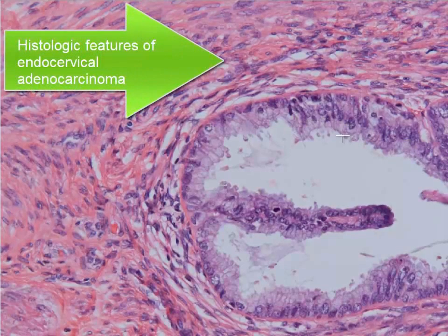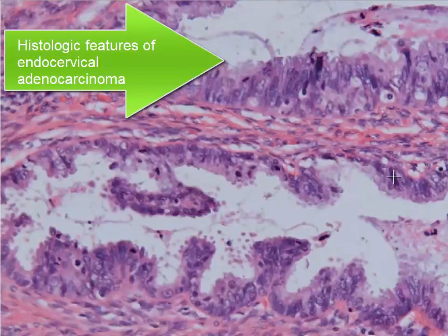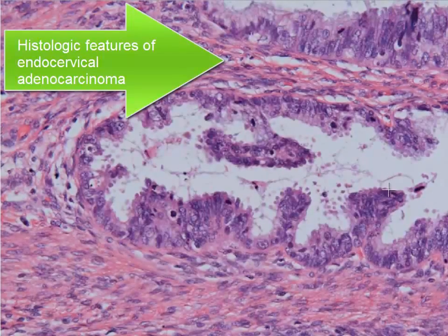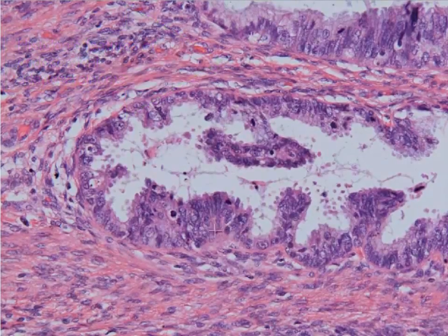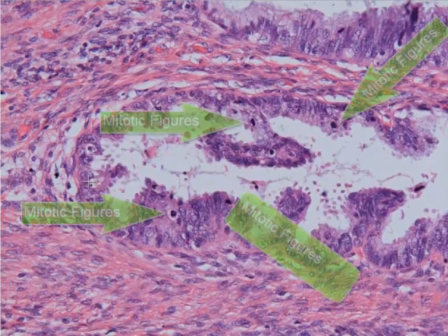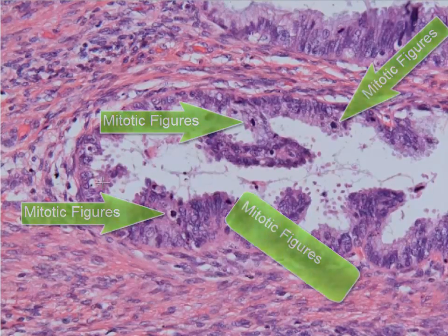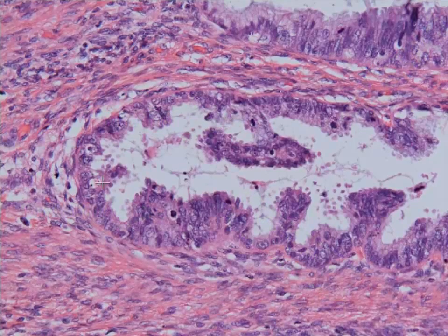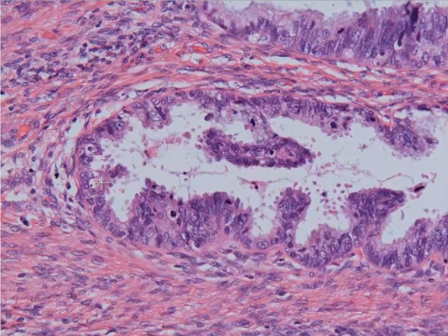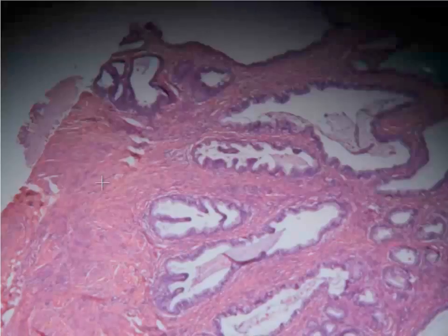You have basally oriented nuclei that line up along this pink basement membrane and they look like they're behaving themselves. As you move to the right, the nuclei begin to stratify and there is an increase in mitotic activity. Right next door, you can see what we would call adenocarcinoma in situ — the nuclei are stacked up on top of each other, stratified, with mitotic figures and apoptotic debris, indicating a high level of cell turnover. This is neoplastic glandular epithelium, not yet invaded, but it is adenocarcinoma in situ associated with HPV infection.